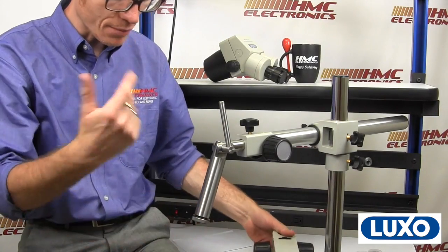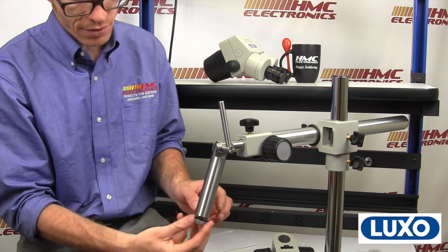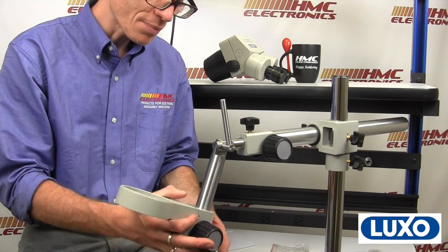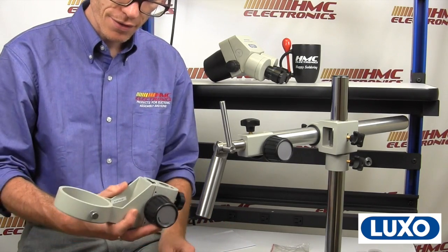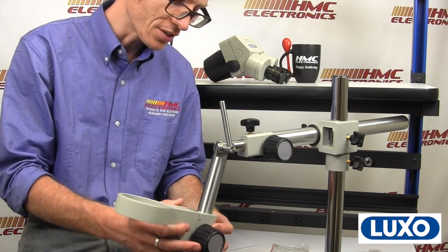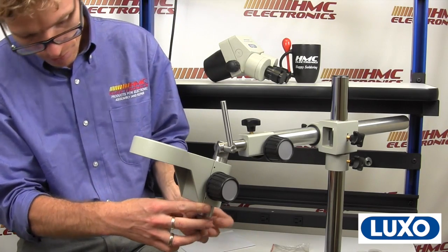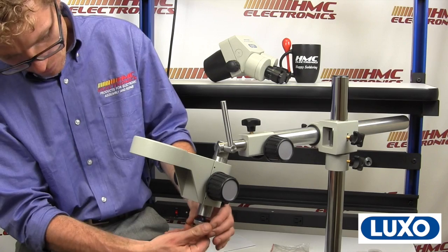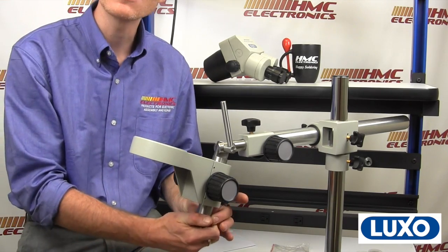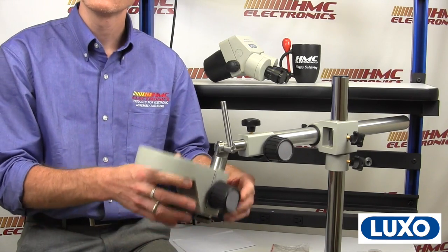So we have assembled the boom stand. We've now got to attach our E-arm, which is the component that holds the microscope. You are going to unscrew this little piece right here, take that off, and slide this on. I cannot tell you how many places I've been where they have put the E-arm in upside down. Call me a traditionalist — we'll put it in the proper way. Now, why is this washer important to install? This little ring is slightly larger than the opening on the E-arm, so if you were to accidentally adjust your microscope and let go, it doesn't fall to the floor. Microscopes don't like falling to the floor.